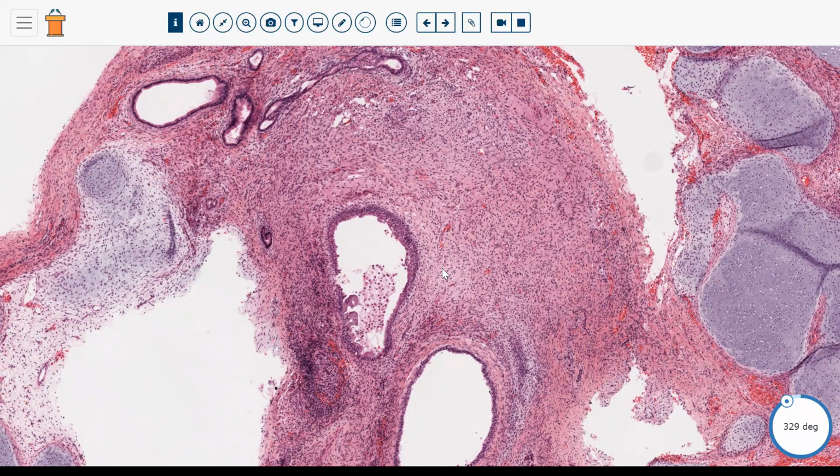So again, use those very restrictive criteria. Even if you have what looks like a pure teratoma in the adult male testis, it doesn't matter if it's mature or not. If you have any of those things, atypia, GCNIS, abnormal spermatogenesis, you should interpret that as a postpubertal type of teratoma, and maybe even make a comment to your clinician that despite being a quote-unquote pure teratoma, this is likely malignant and the patient should be staged.